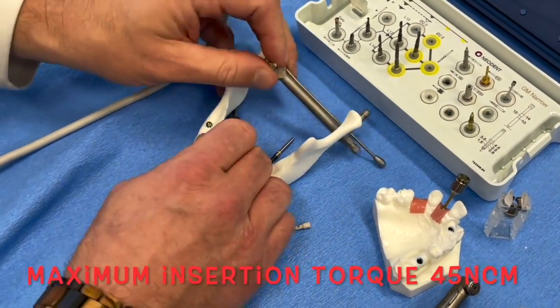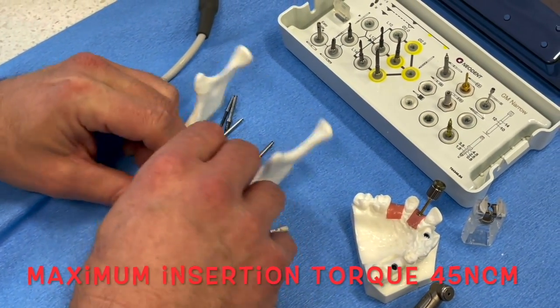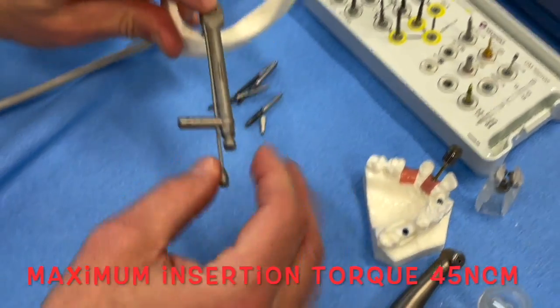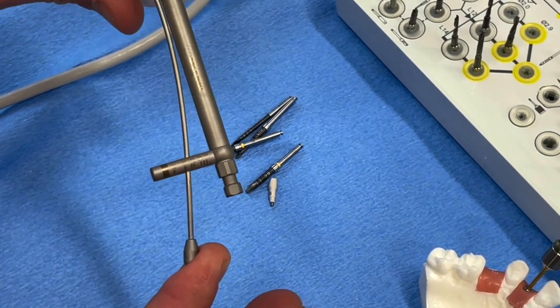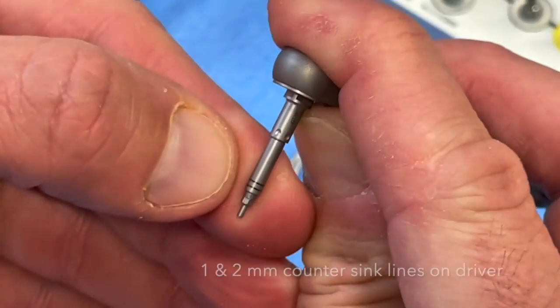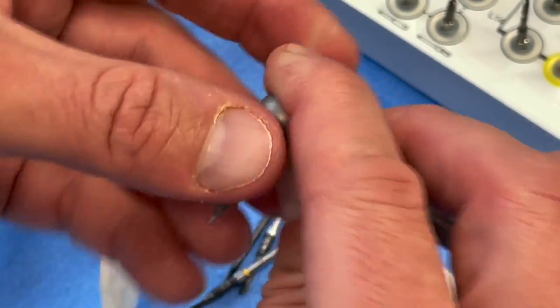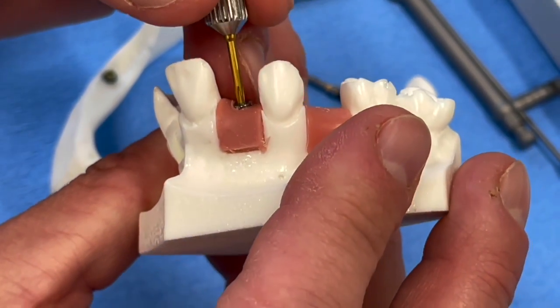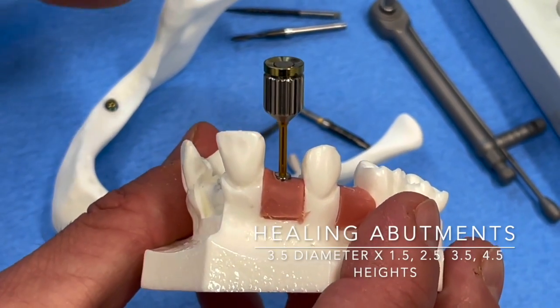Important note: this implant has a max torque spec — you need to get it down in there. Because it's such a small diameter, sometimes you have to take the driver apart, push, and get it seated. In this case my implant torqued at just past 45 — actually at 50 before it started to move. The implant has two lines on the side for 1mm and 2mm countersink depth. I caution everyone: probably only go in 1mm into the bone, because the max height on our healing abutments is 4.5mm. If you countersink 2mm in the anterior where tissue is thicker, you may be challenged.